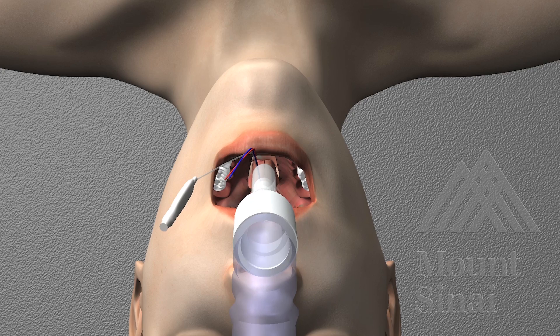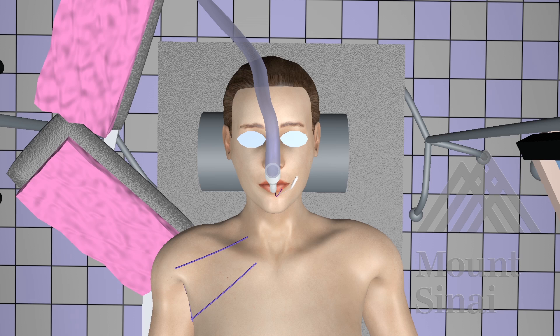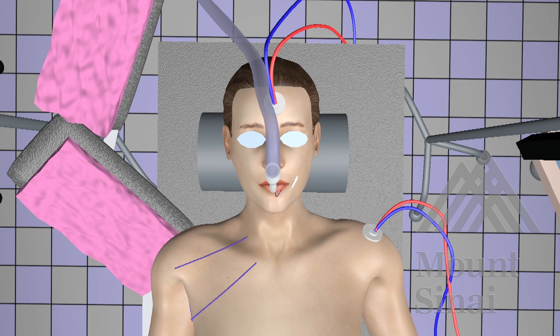Once inserted, the electrode should sit adjacent to both vocal cords. Next, you can complete the nerve monitoring circuit by placing the grounding electrodes as indicated by the device instructions. Here, we have done so on the forehead and left shoulder.